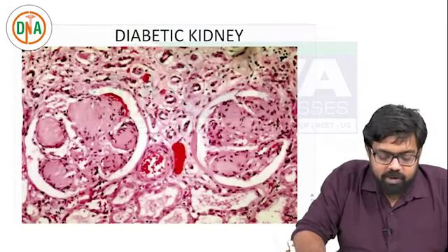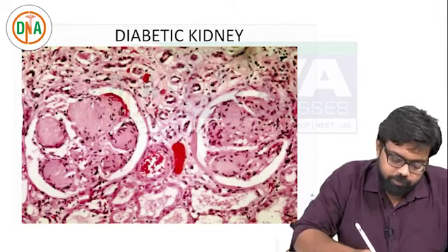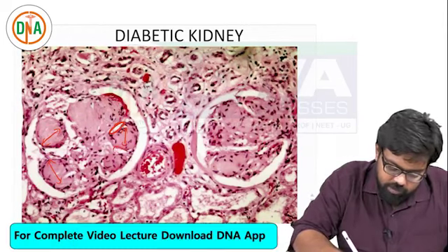Next is about the diabetic kidney. Many times you come across an image which is showing some nodules, and those nodules are in between two capillaries.